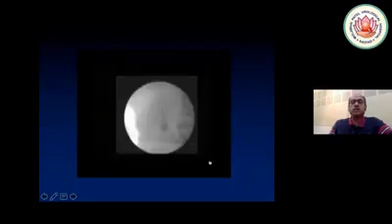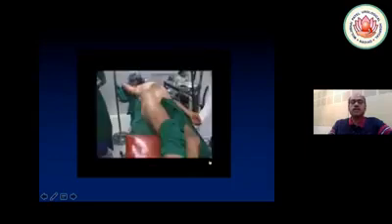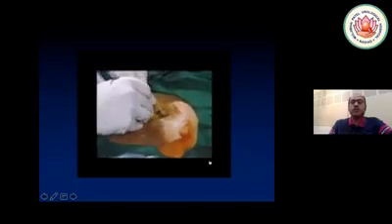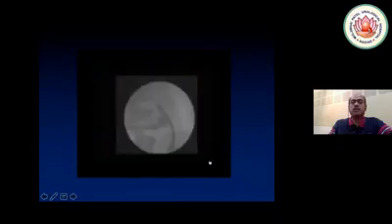As for any PCNL, the first step is to put a ureteric catheter, and this is a very important step. You give a little bit of a tilt and confirm again how you are going to see the kidney. Is there any bowel or any organ between the skin surface and the kidney or not? And if there is none, that's a perfect case. Now here you can see that an ultrasound guided puncture is made into the upper calyx. You get this into the lower calyx. You get the fluid, and then you can see here that the contrast is injected from the needle.